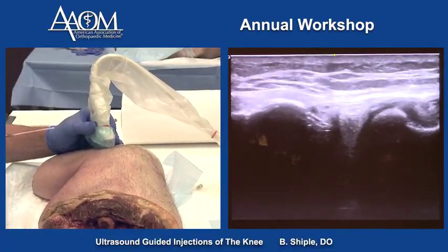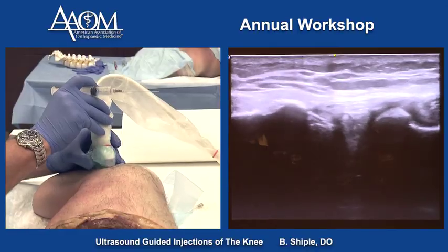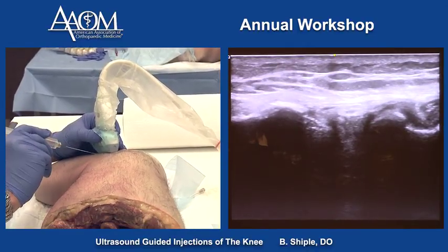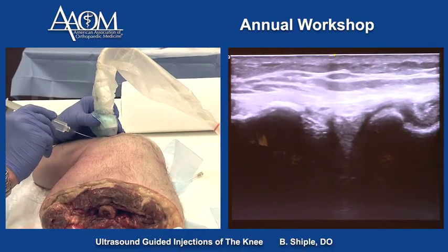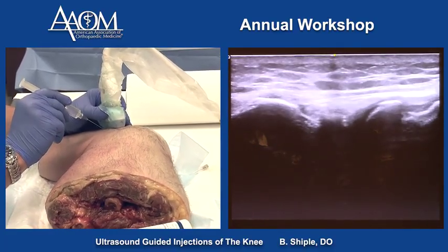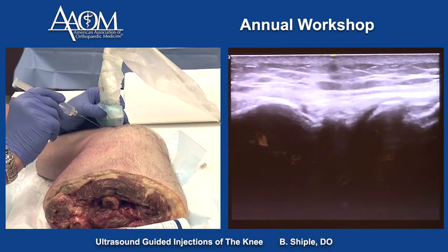We can also show you getting into the lateral meniscus — into the body of the lateral meniscus if you had a tear there. Same short axis technique, one centimeter away, and the needle is in the meniscus right there.